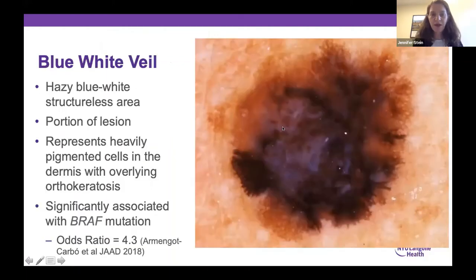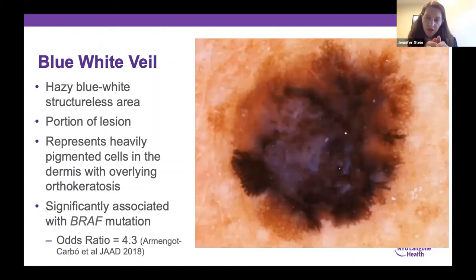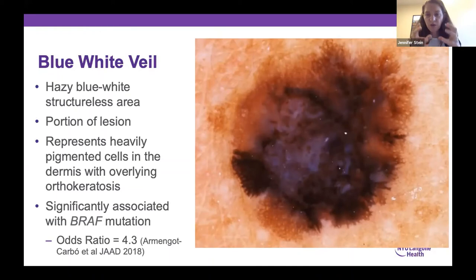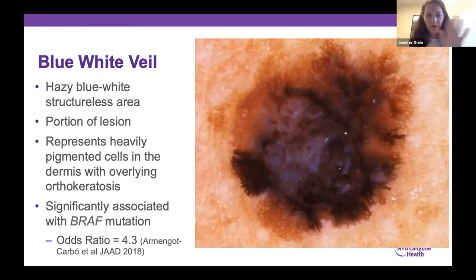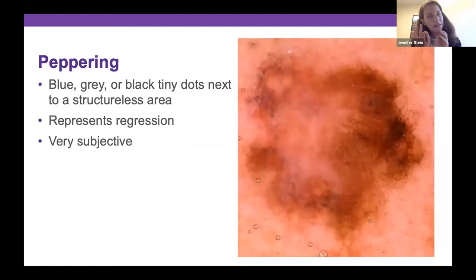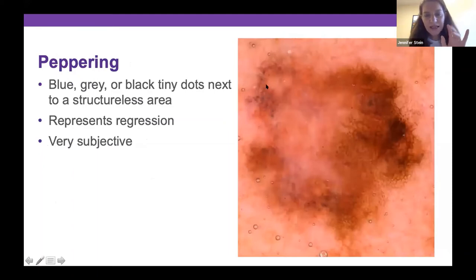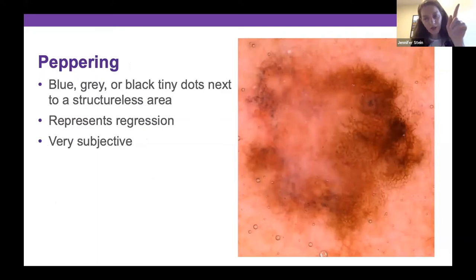A blue-white veil is a hazy, blue-white structureless area covering just a portion of the lesion — as opposed to the blue nevus where the whole thing is blue. It's blue because there's a lot of melanin deep in the dermis with some white from overlying orthokeratosis. Blue-white veil is bad news. Peppering is more subtle — little black-gray dots like sprinkles of pepper next to a structureless area. That usually represents a regressing melanoma. It's subjective, but if you think you see it, that's a reason to worry.